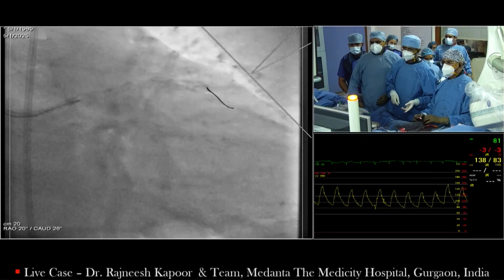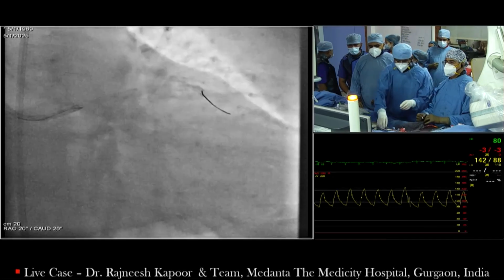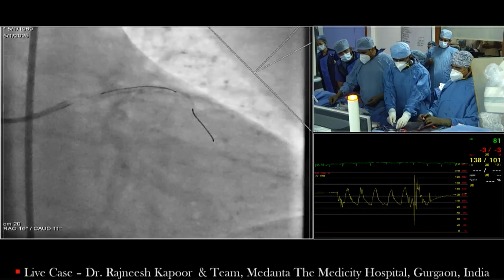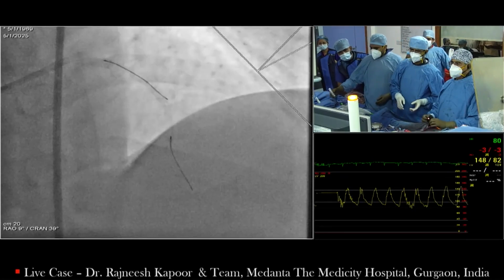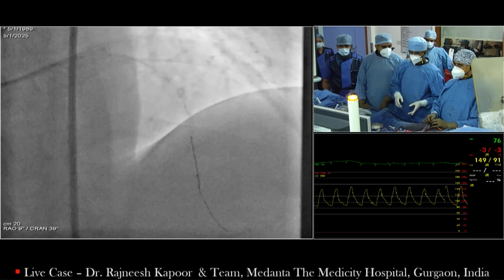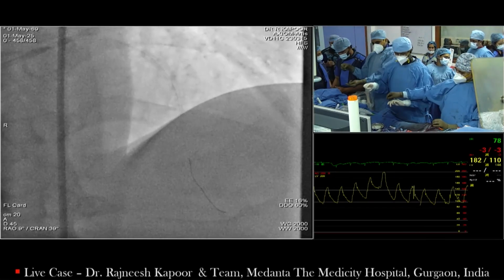There are regulations that differ from state to state, right? In Pennsylvania, you cannot touch these patients. In West Virginia, you can touch these patients. We are just across the state line, so it differs from place to place, and I don't think medical societies or guidelines alone can restrict this. But if some center wants to do rotational atherectomy without a surgical backup, making sure to have covered stents and some sort of mechanical circulatory support device is very important.